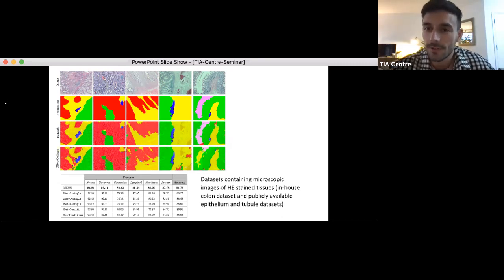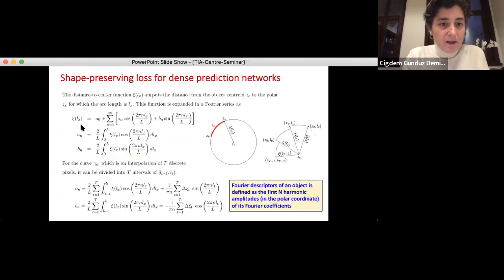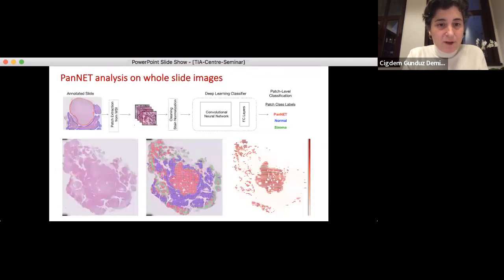So a lot of the approaches, well, most of the approaches that you spoke about today are segmentation based, right? So when would you choose to use a segmentation-based method for analysis rather than, let's say, for example, a patch-based classification method? So again, it depends on what kind of resolution you're interested in. So I gave that example. It is just from a work in progress.